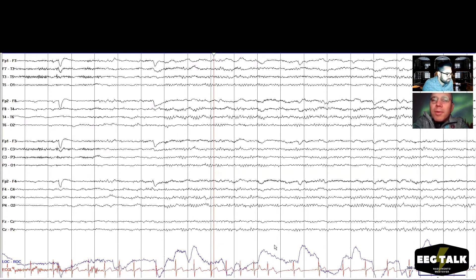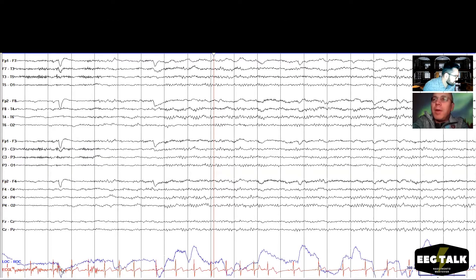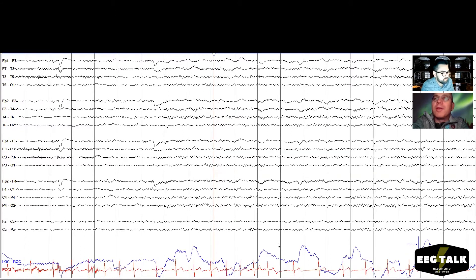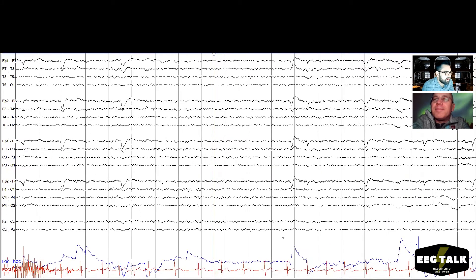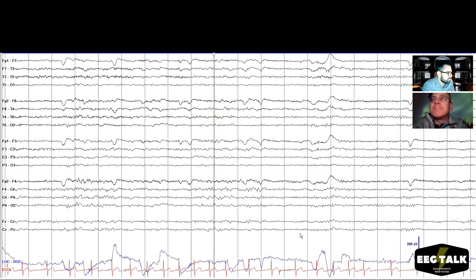We can't forget to look at the EKG. The intervals between the QRS complexes are a little bit off. We can't really make a diagnosis from this, but it's always good to mention. A kid coming into the EEG lab actually has a heart problem — this is a chance to catch that if it's true. We should mention this when we write our report. So far still awake, a lot of eye blinks, nice PDR, symmetric.